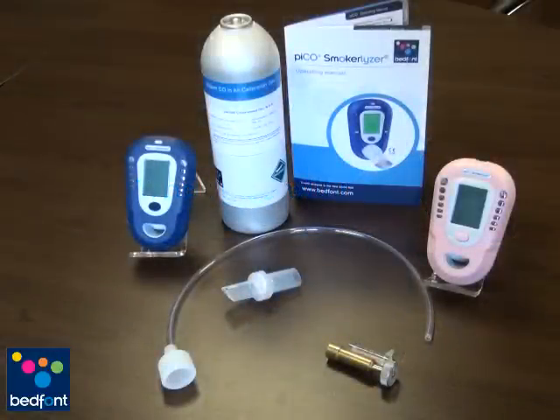Bedfont Scientific can supply everything you need for calibrating the PicoPlus in a handy kit. It is strongly advised that you use Bedfont's calibration kit, as using other alternatives can damage the unit or create false readings. Please ring Bedfont or your local distributor to obtain one.